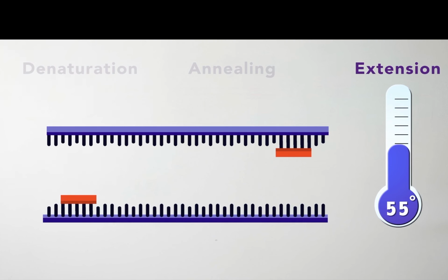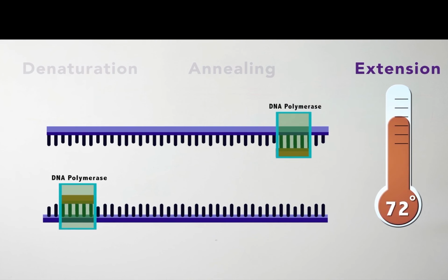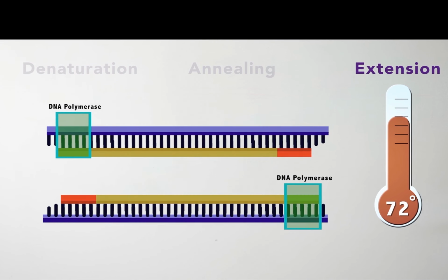That is where extension comes, and that is where our Xerox machine, the photocopy machine, comes in, that is DNA polymerase. Remember in the master mix we had DNA polymerase and other building blocks, the nucleotides. So DNA polymerase will take those nucleotides, and as I told you, by the base pair rule, a particular base will attach to a particular base. Based on that, they extend the new strand also. So we took one double strand and made it into two double strands at the end of extension. Here you can see the temperature also varies: 94 degrees in denaturation, 55 degrees in annealing, 72 degrees in extension.